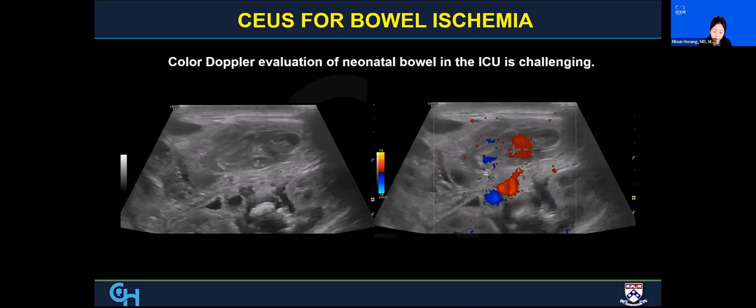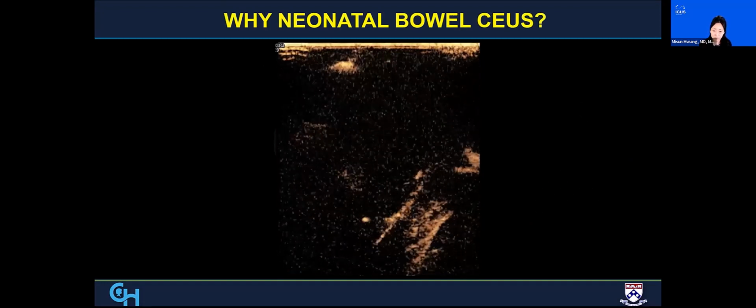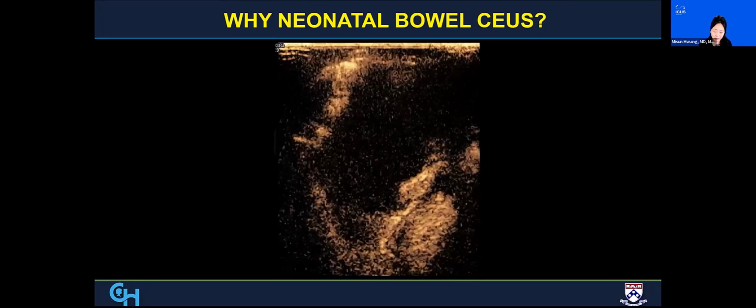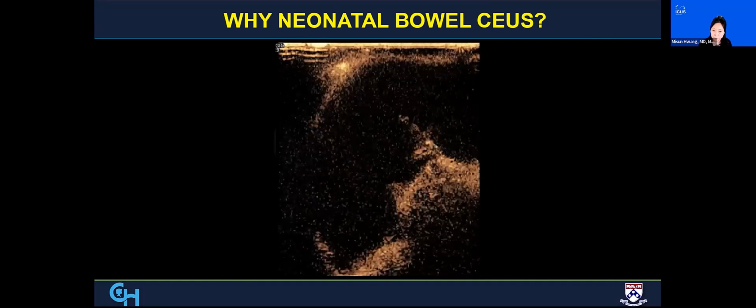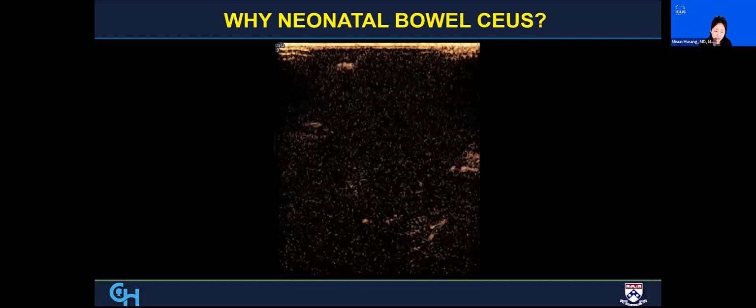Well, the clinical concern was very, very high. The infant was not doing well. And I think whatever we could provide, they were appreciative. So we went up and performed contrast ultrasound at the bedside. And what you're seeing actually is non-enhancement of the entire bowel. And that was impressive, to the point that we were questioning our technique, but what you're seeing is non-enhancement, absolutely nothing whatsoever. So what happened in this case was we saw no enhancement.